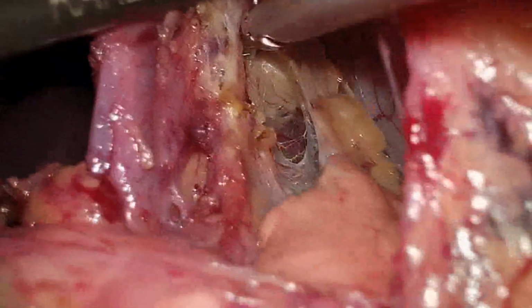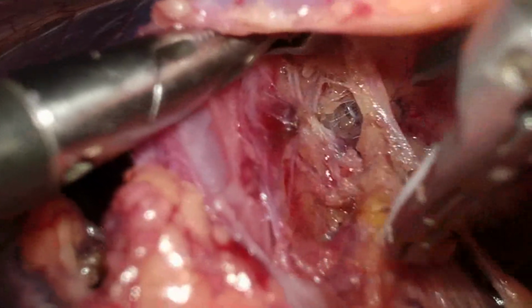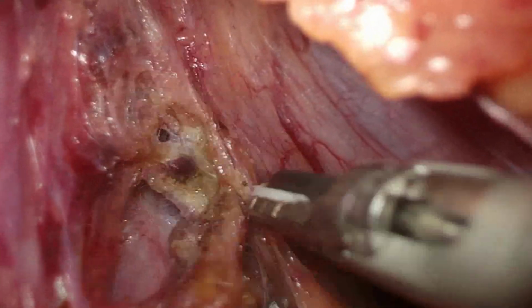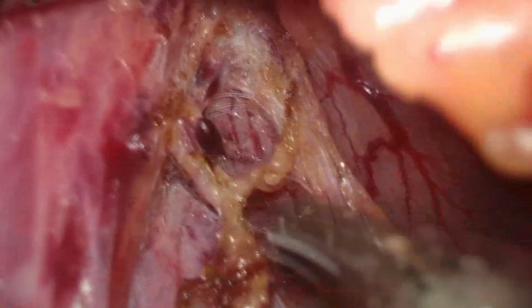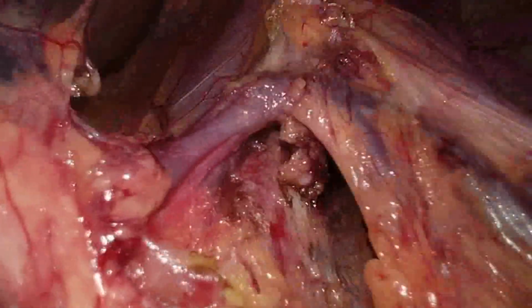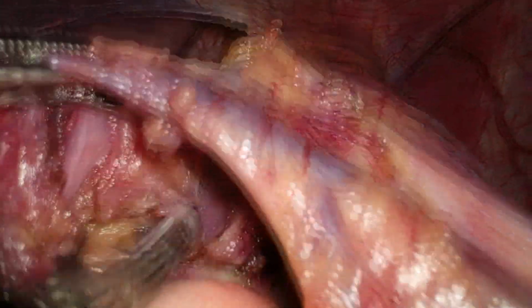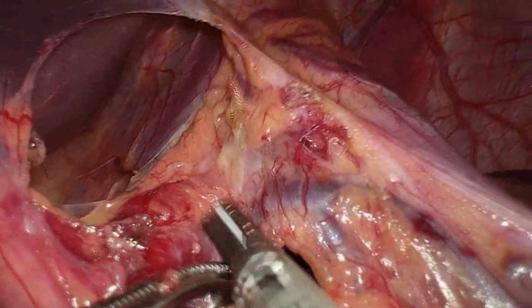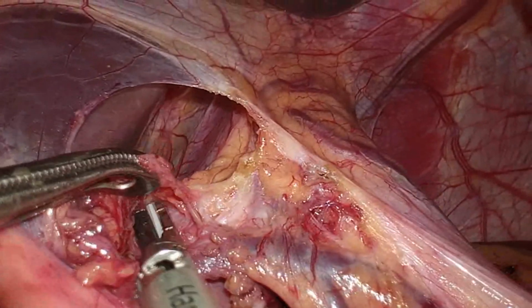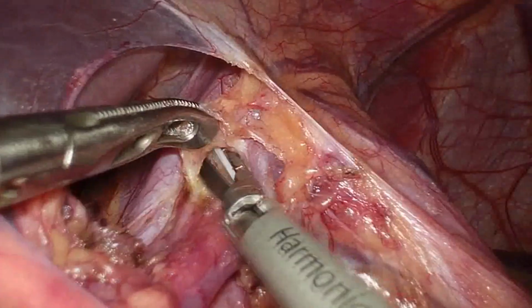So this is the dissection on the crura. In this step, one has to be careful and identify each branch. You can see here the left gastric vein. So we are lifting it up and dissecting the right crural fibers. All the fibrofatty tissue adjacent to the vessels is excised.